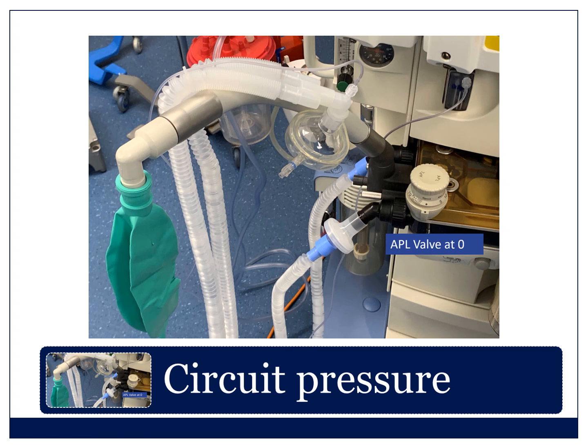Finally, this is the test I do in every single patient. You've got your circuit ready, the APL valve is at 0. That's normally how you start an anesthetic. I turn that APL valve to 20 or 30. I put my hand in front of that face mask, so I occlude the end of the circuit. I put the gas on so that the bag fills, and I squeeze the bag, and that's testing all sorts of things.